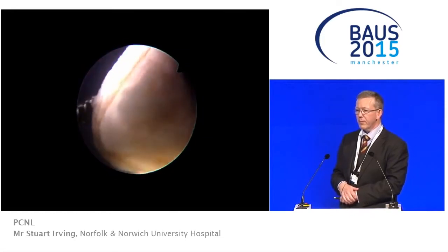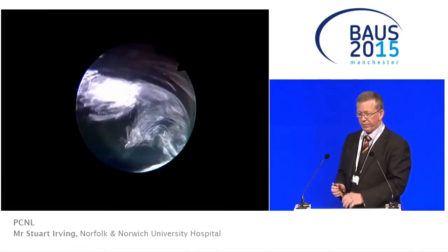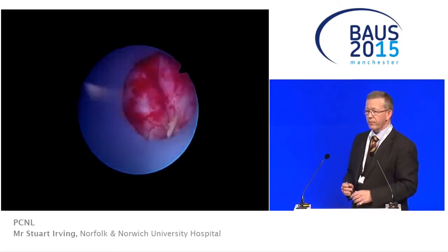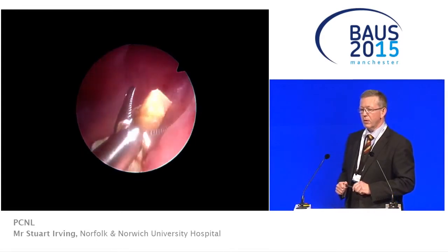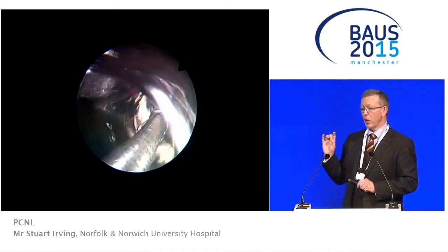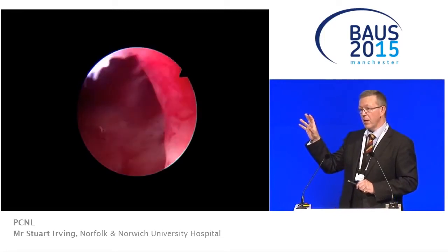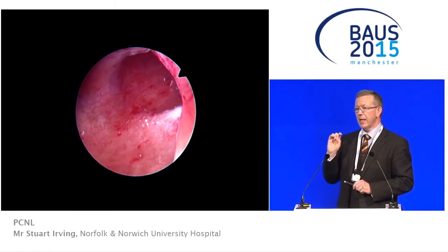The only question I have here in terms of the stone, you mentioned that it's probably difficult to go from the bottom. As it's not radio opaque, do you think it might be, more like it's infectious stones, or what was the analysis? Well, they are radio opaque. This was a struvite stone, but they're not densely radio opaque. So you could see it on the plain film. So it wasn't uric acid then? No, you could see it at the beginning, but you couldn't see it clearly intraoperatively.